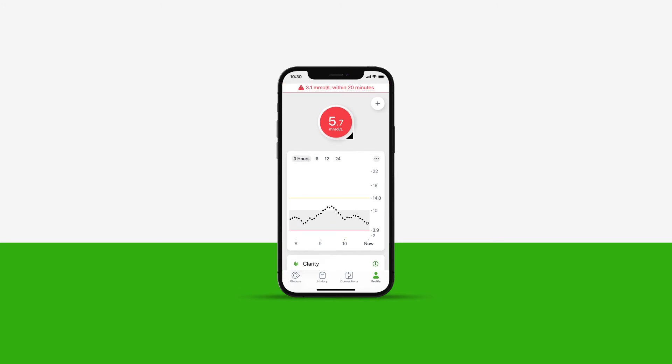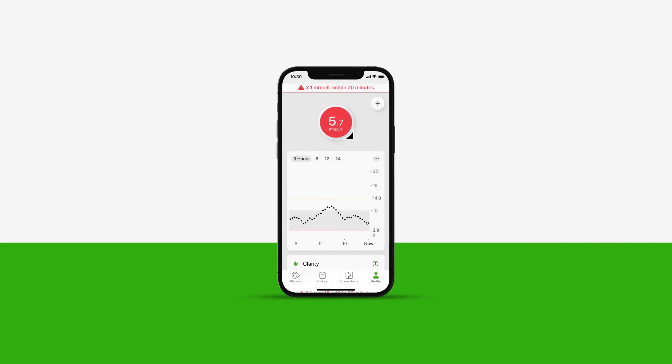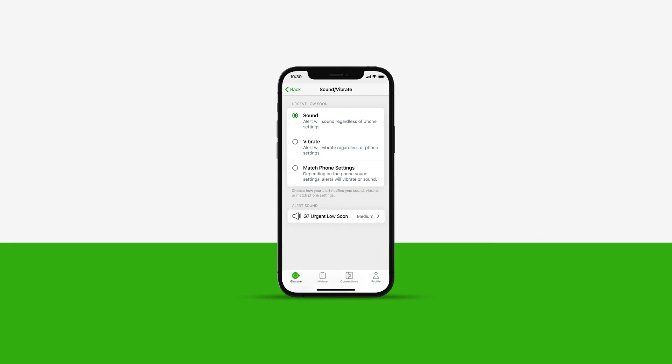Moving to the urgent low soon alert. This is an alert that will alert you when your sensor reading will be at 3.1 mmol per litre or less in less than 20 minutes. In your menu, you can also customize the alert notification.